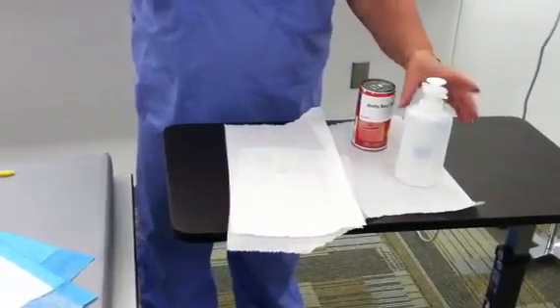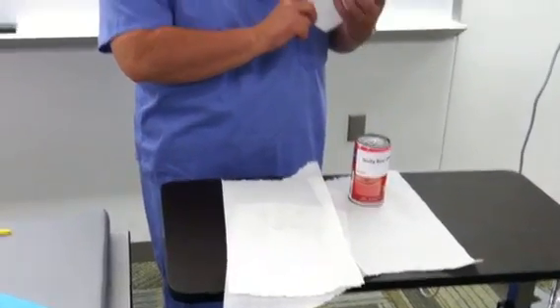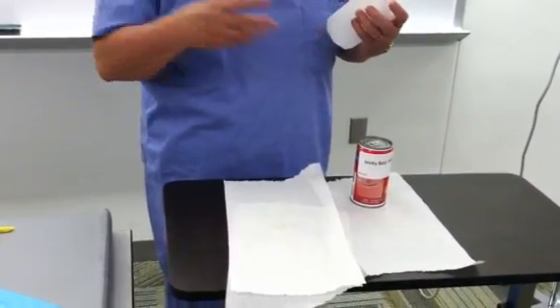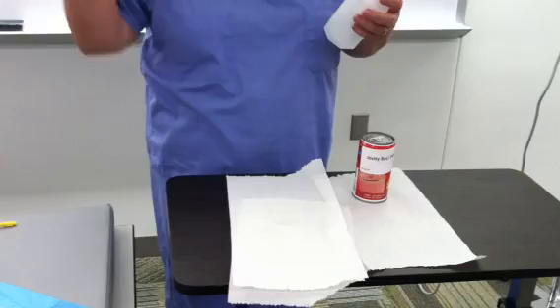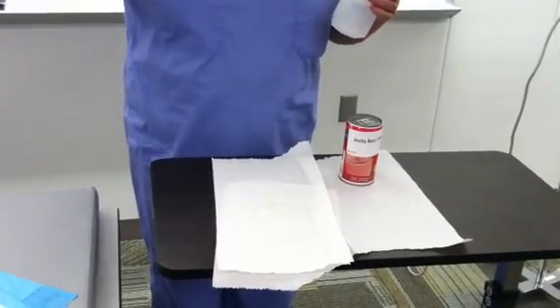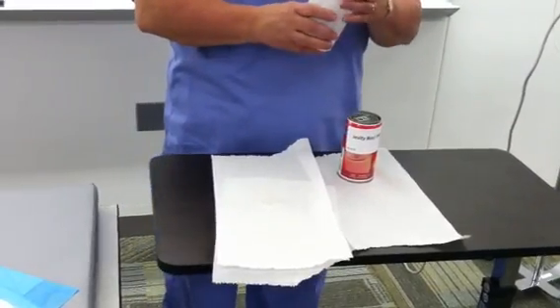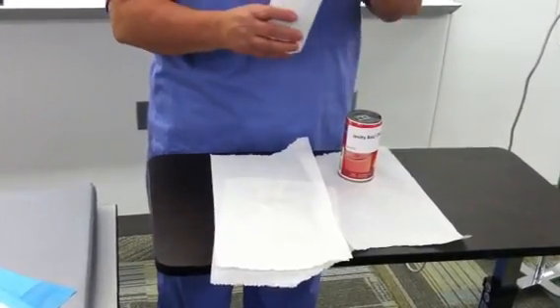So the first thing I'm going to do is add water. I've measured my water. I've gotten water either from the sink in the patient's room, or I could have brought a cup of water in from the kitchen, because I don't like bathroom water, but that's just me.